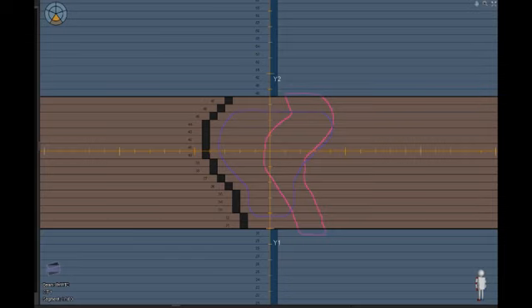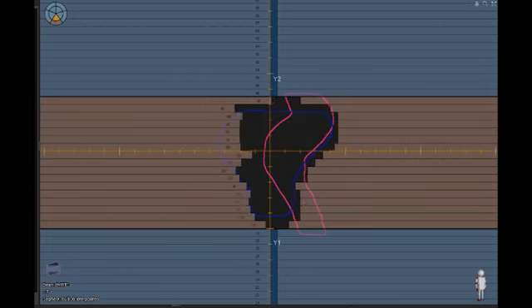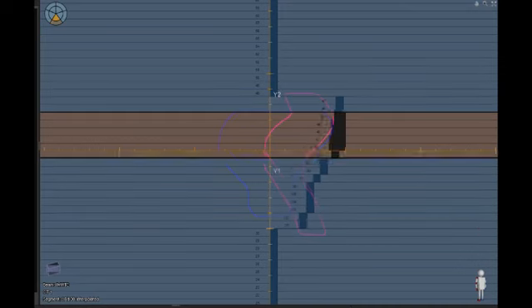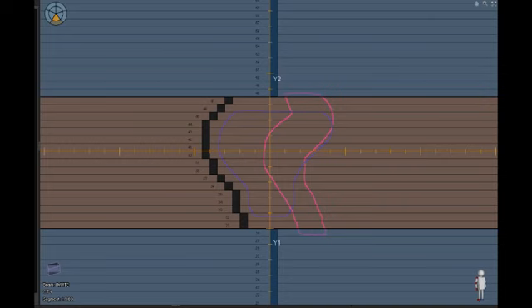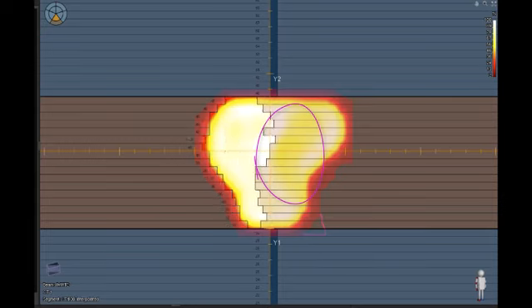So here you'll see the leaves, and if you look in blue, you see the PTV. The leaves are moving dynamically as the beam is left on, and as they do that, they distribute dose. So you can look at that fluence. So I'm going to turn that on here. So this is a fluence map, and you'll see a region in here that's kind of like a lower dose. I'll watch the leaves as they move across.